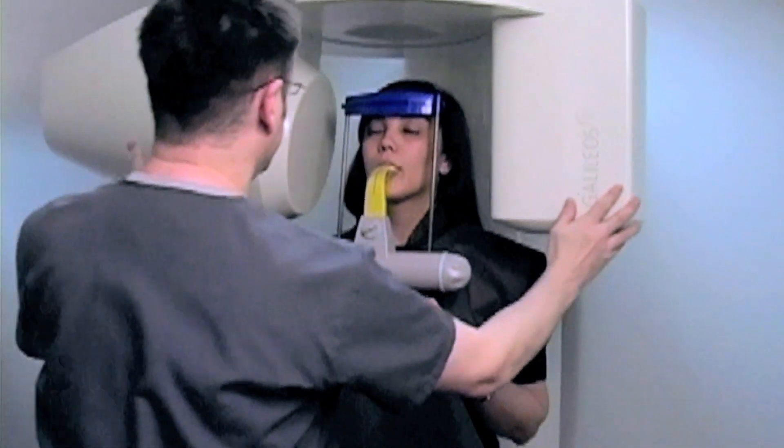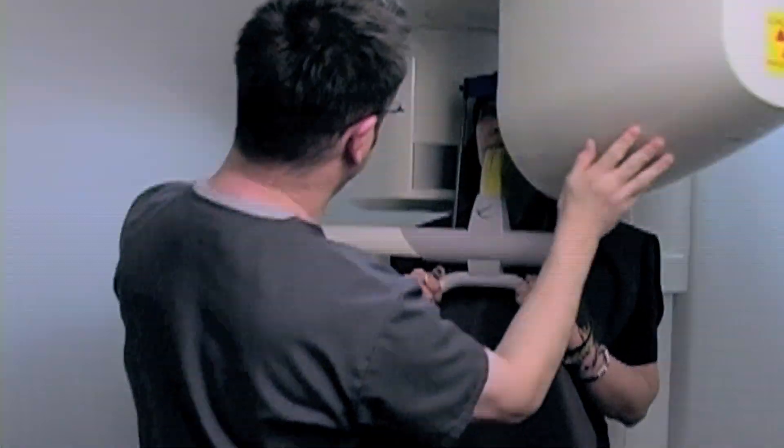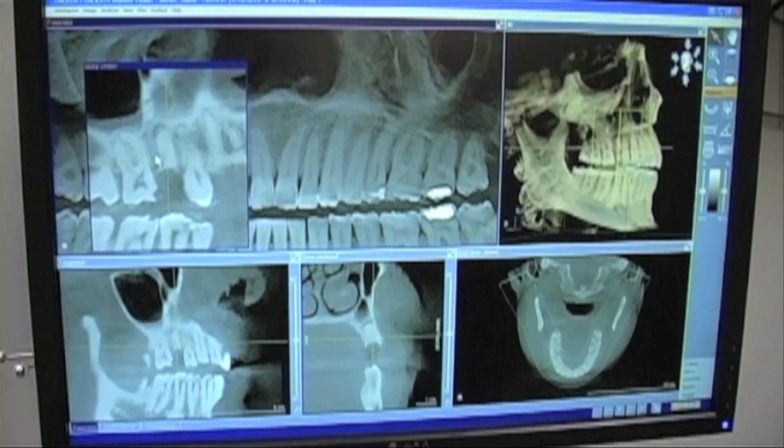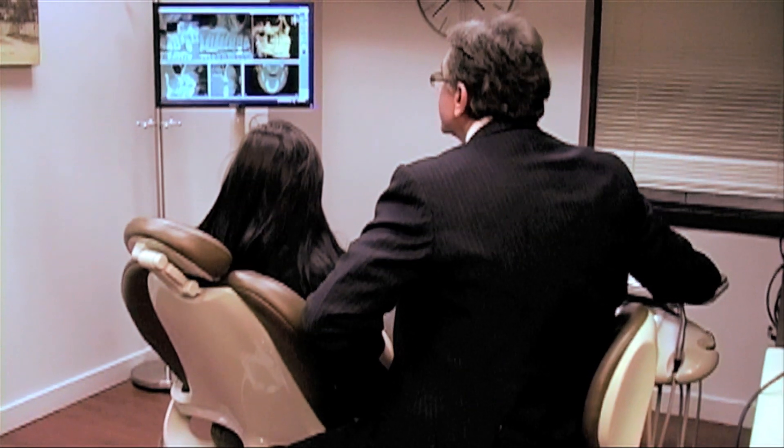That was it. Let me wrap this back around so I can let you come out. So Jamie, this is a digital pan — you can see the cone beam that we took.